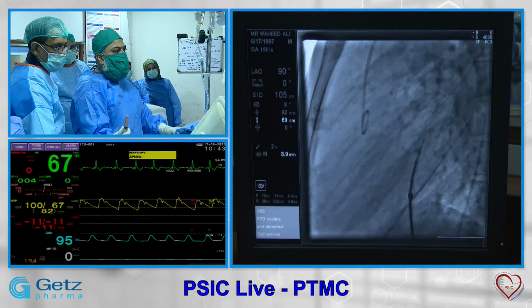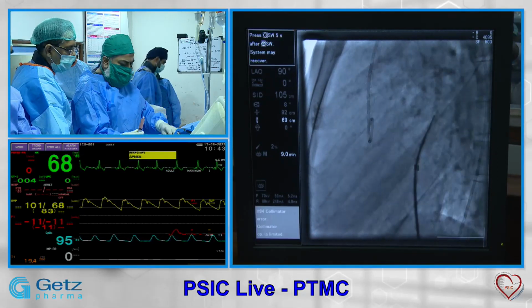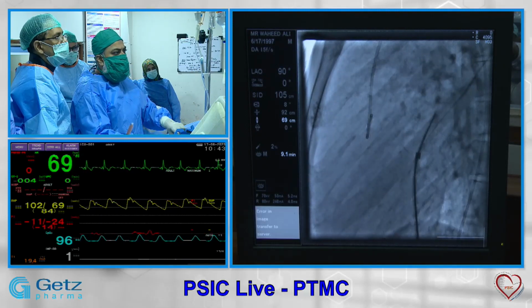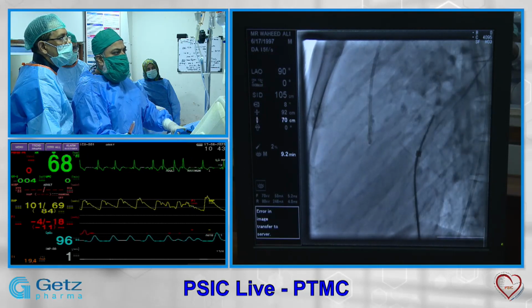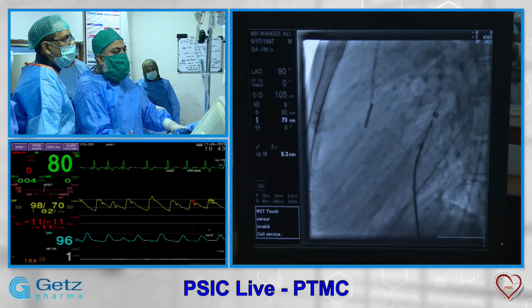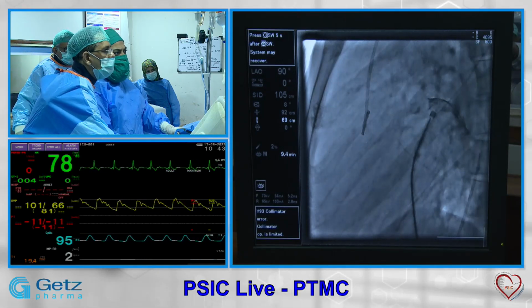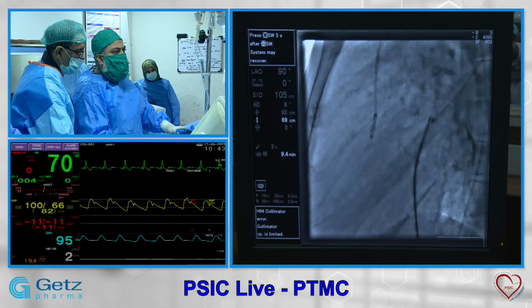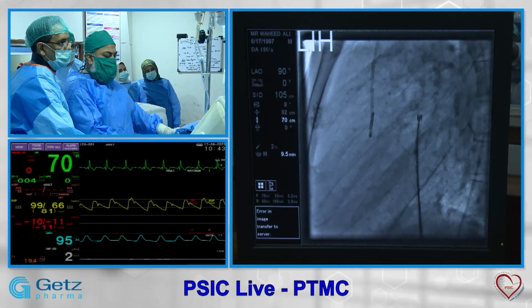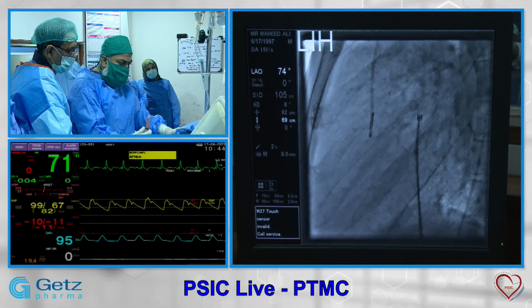So we are in the LA and my cursor is directing towards 5 o'clock. We'll introduce further, so that our needle, and now I hold the needle and take the dilator and things forward. Now I hold the dilator and take the sheath forward. If you want to confirm that we are in the LA or not, you can still give some dye. So we are there, and then we rotate again to 3 o'clock. And now our working will be in the RAO view. Next please. RAO.